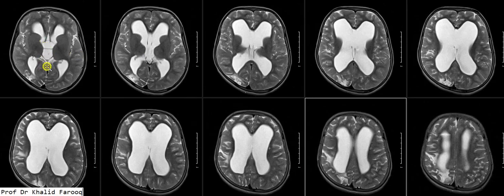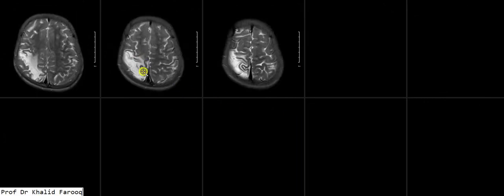There is an area of gliotic changes in the right parietal lobe posteriorly, most probably because of old ischemic insult in the distribution of the right MCA. Here you can see the gliotic area.